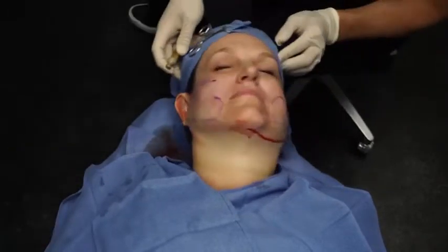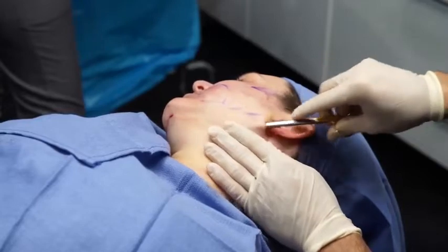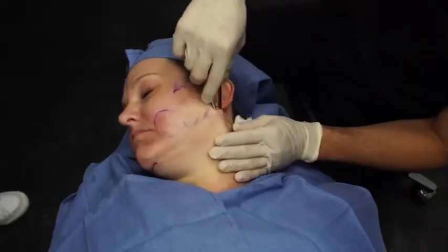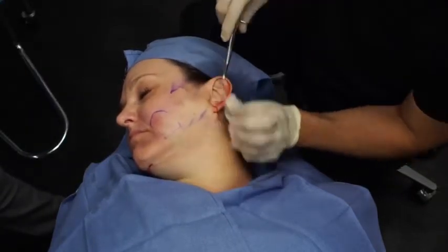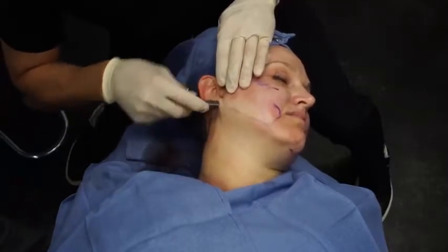The right for me, scissors. Okay. We've already made our 15-blade incisions, but we're going to go ahead and dissect here a little bit more just to prepare for gas egress. This is the point at which the greatest amount of resistance is found. There you are, right there.